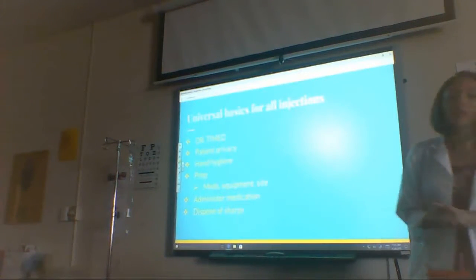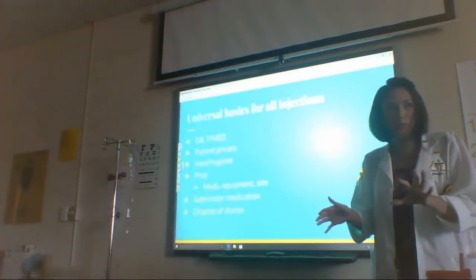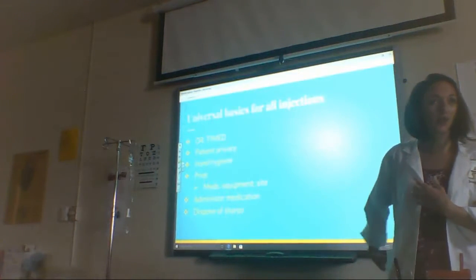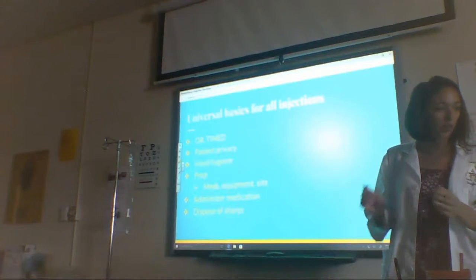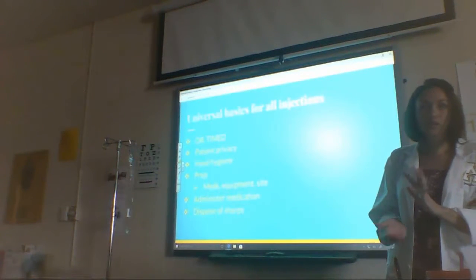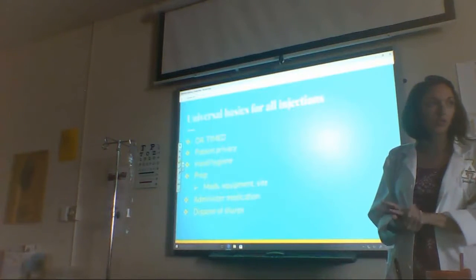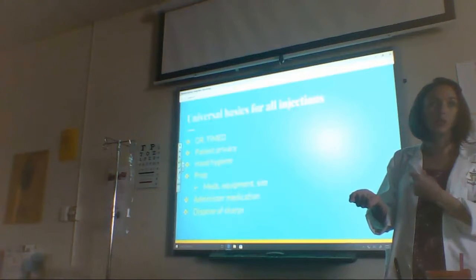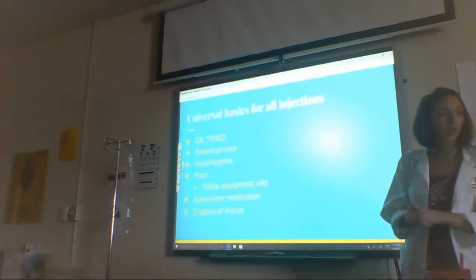Patient privacy. We don't want to give each other injections here in the middle of class. It's not the flu pod, especially if it's going to be in a sensitive area like the thigh or the gluteal region, so be sure that your patient's in a private curtained area. Hand hygiene, as always: we're going to either wash our hands or use the hand sanitizer. Put gloves on to give all of our injections, and once we're finished, take the gloves off and use hand sanitizer on the way out.